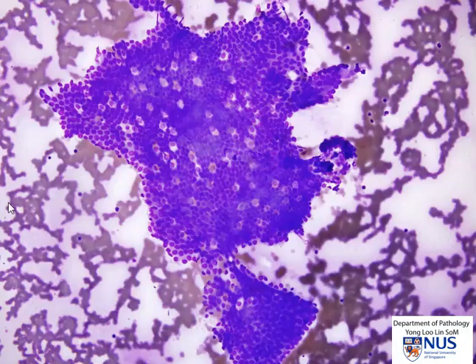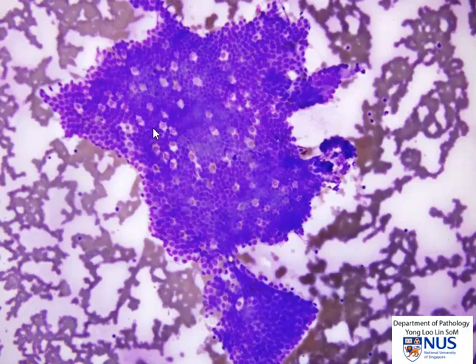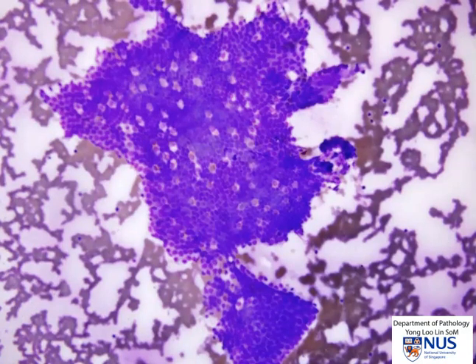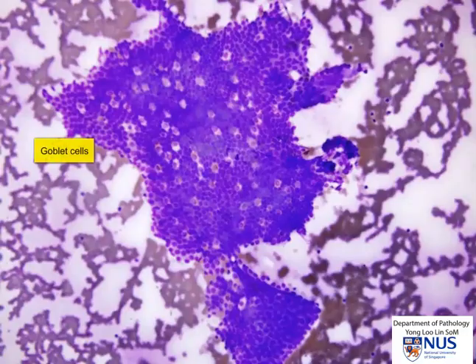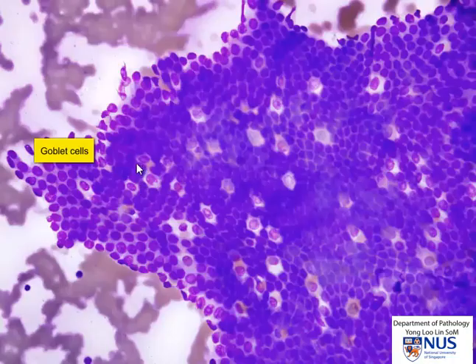This is another sheet showing very clearly the holes that we can see as we focus up and down, and the holes actually represent goblet cells and we can see them in a higher power view here.